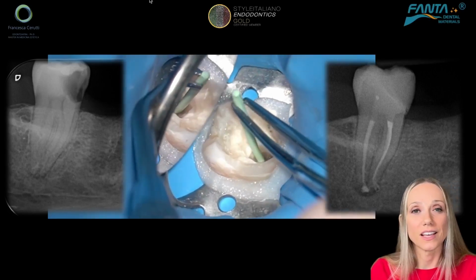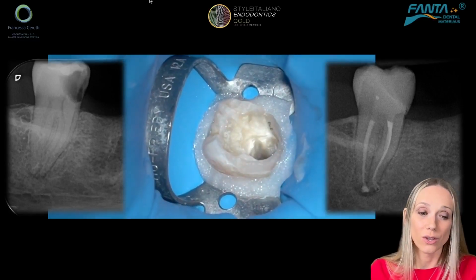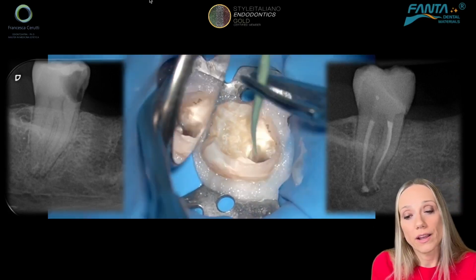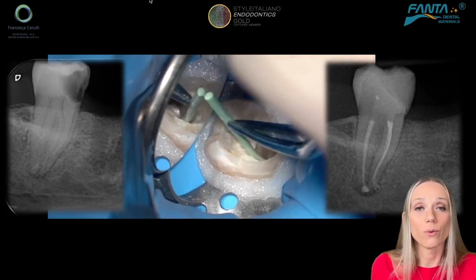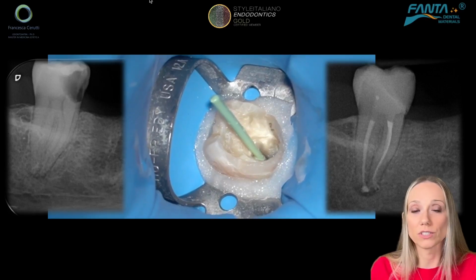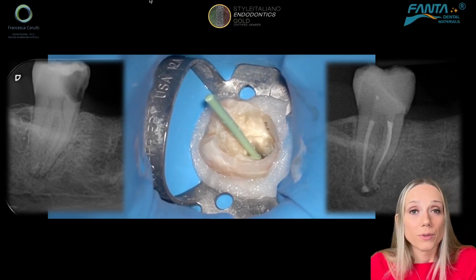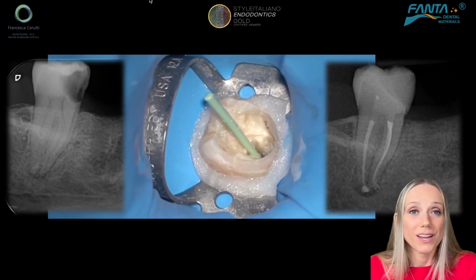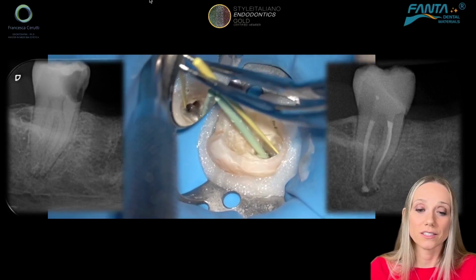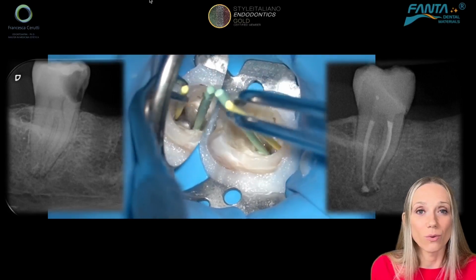This is another case in which I used the single cone bioceramic sealer technique. Why? Because I have thin, long roots, and so why not? And you see, in the distal canal, I was able to fill a lateral canal. And in the mesial, there is a bifurcation. I was able to fill the bifurcation. With what? Probably part with gutta-percha, part only with the sealer, but I don't care, because this way my filling is three-dimensional and is adapting to the shape of the root canal. So there's nothing I want more than that.